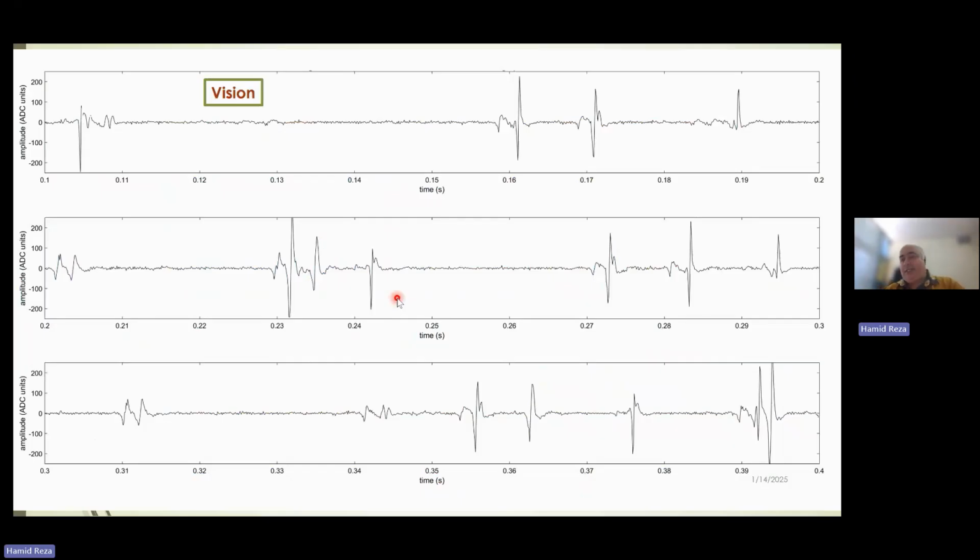So I'm going through this template matching technique from the signal. Let's focus on the problem. Suppose that we have a filtered signal. You can see from 100 milliseconds to 200 milliseconds, and then another epoch and another epoch. We have 3 epochs. When a clinician would like to decompose it, the clinician looks at the signal and also hears the sound of the signal.